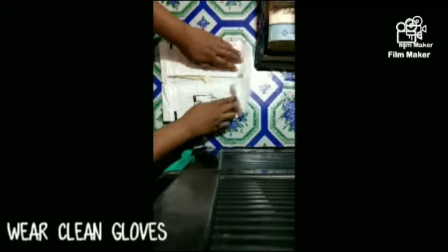Hi, Mrs. Smith. May I see your identification band? Okay. So, Mrs. Smith, I will be removing the catheter. I will inform you that there may be slight discomfort as the catheter is removed. Okay, thank you.